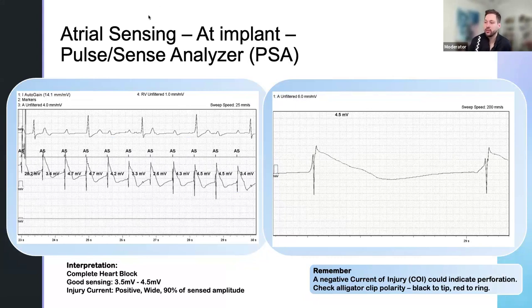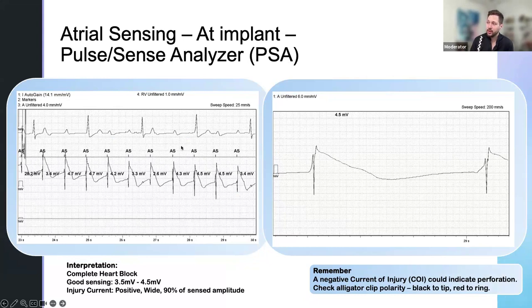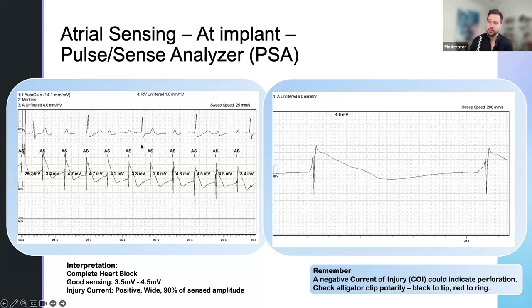We now move to the atrium — we unhook the ventricle. Looking here, the ventricular signal has nothing going on. You have your marker channel, your atrial channel, and your surface. As you can see, the patient is in some sort of atrial tachycardia, probably compensated. There doesn't really seem to be an association between the QRS complexes and the P waves, which indicates to me this is probably complete heart block. These are most likely not conducting down. However, there is a very narrow complex, which means it's probably higher up in the conduction system that has taken over from the atrium. The atrial rate is steady, the ventricular rate is steady, and they're not associated — I would indicate complete heart block, but I'd argue it's probably something like junctional as well.